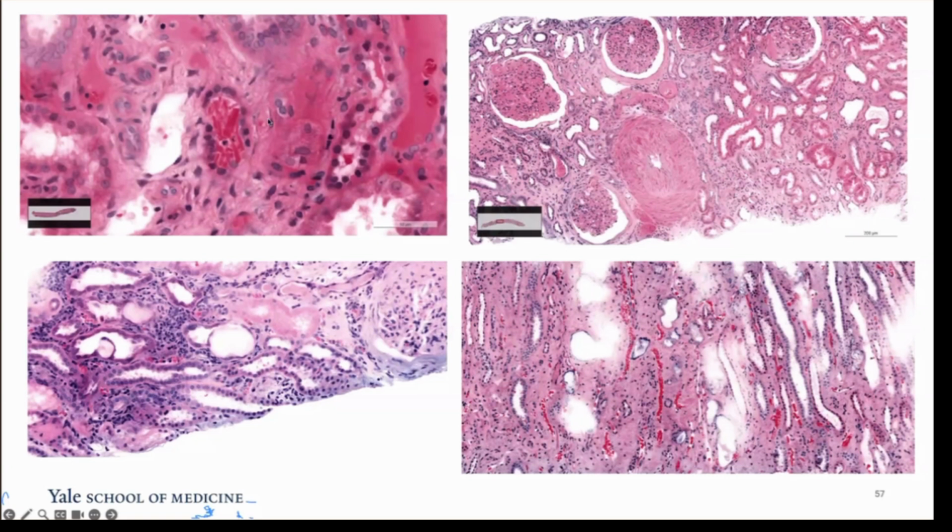For example, on the top left is a profile showing light chain crystallopathy in a patient with monoclonal gammopathy. We can look at vascular profiles and diagnose vascular pathology. It also throws some curveballs. For example, the bottom two panels are crystallopathies. This panel is for someone who had a lot of calcium oxalate crystals, and this individual had a lot of calcium phosphate crystals in the kidney, and the washed-out appearance is because of the way the light diffracts because of the crystals.